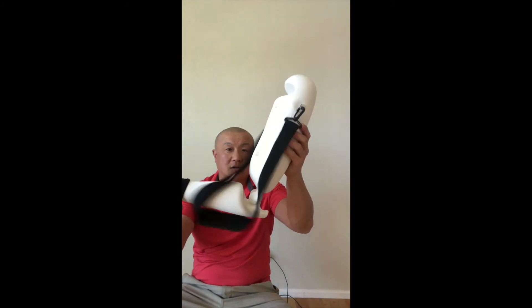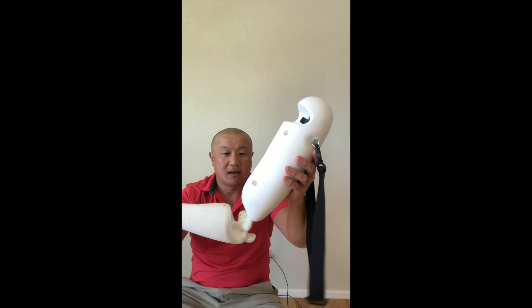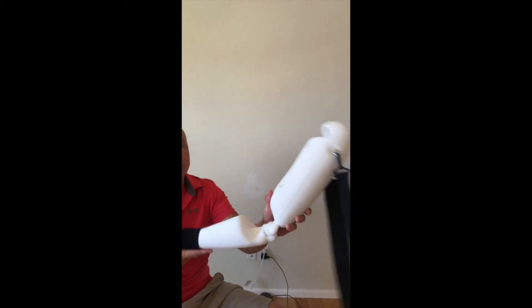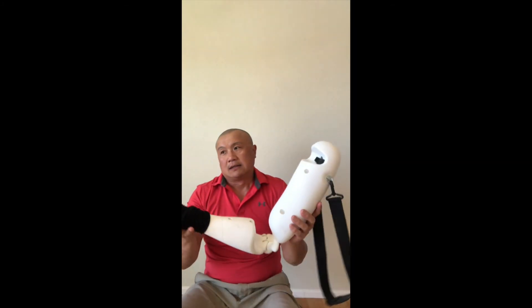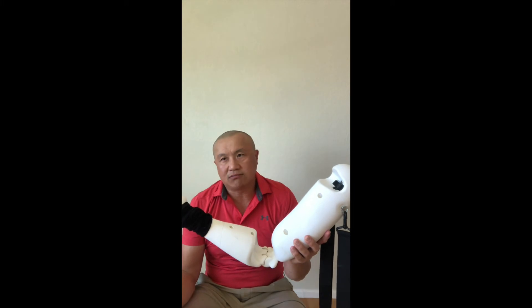You can see how it's dislocated, and then you can practice the reduction technique — single reduction technique — or in an emergency room situation it could be with help. But for athletic trainers, usually you're solo, so you should practice the solo technique.